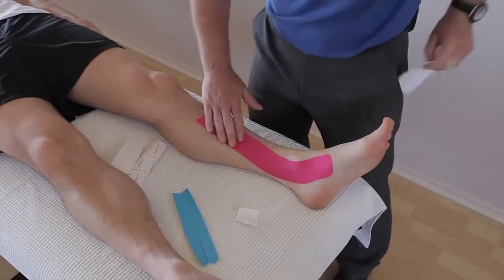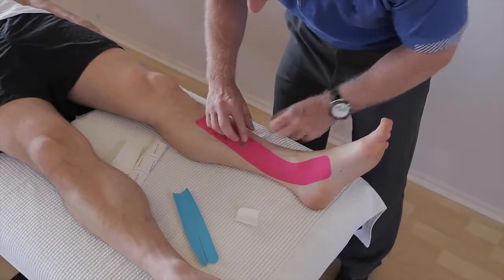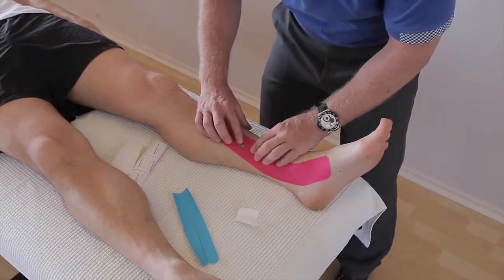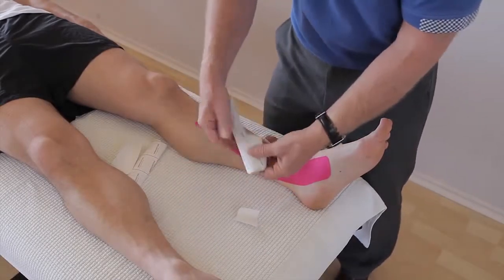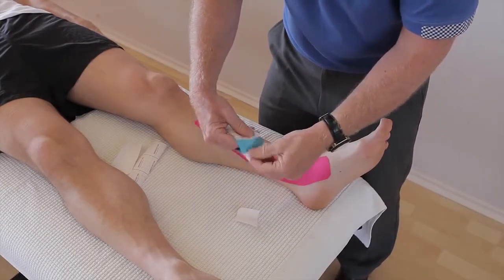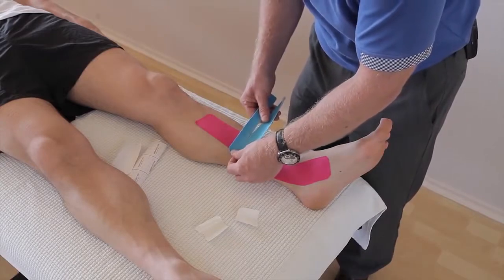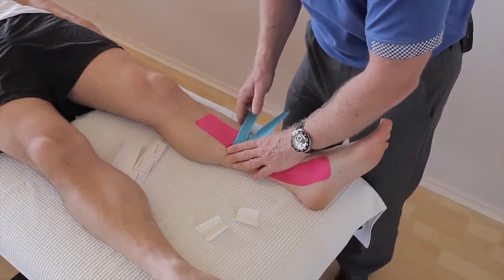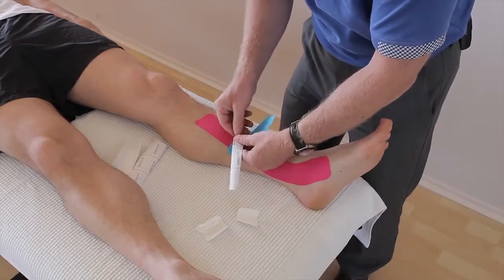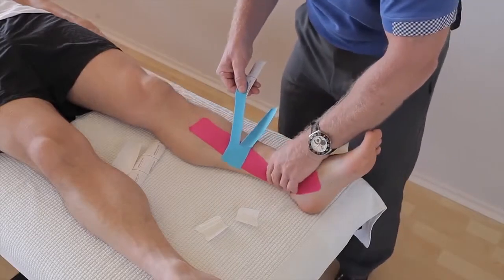Right, we've lost where the pain is now, so let's go back to where the pain is located. So let's say that's where the patient presents with pain. Using the second I strip, that's now a Y, split each of the legs and apply the pad posterior to the pain, like so. If you just notice what I did, just literally pull it so you can break one of the legs, excuse the expression, and then roll the leg inwards, if that's okay.